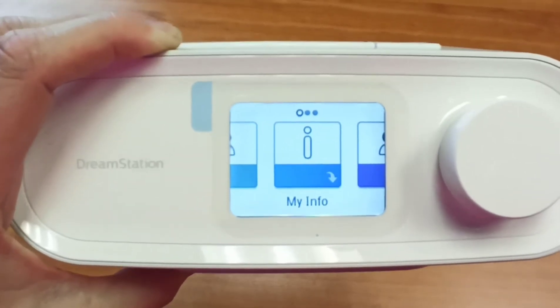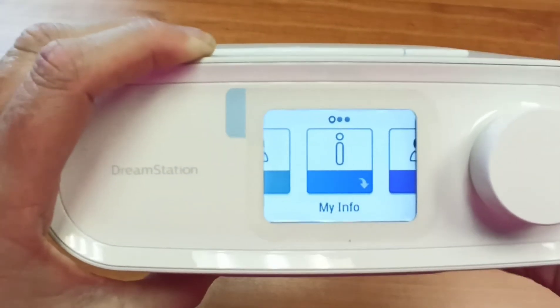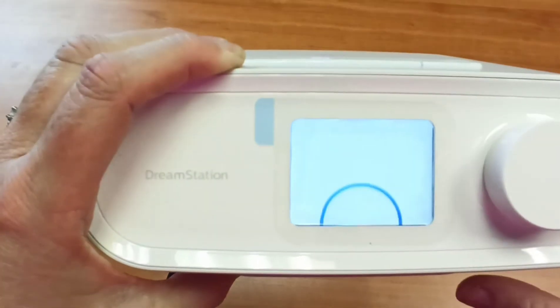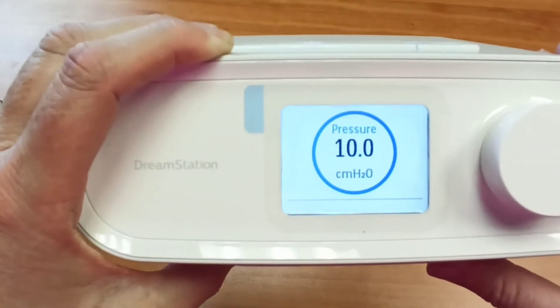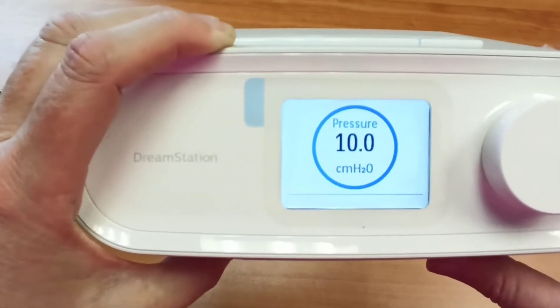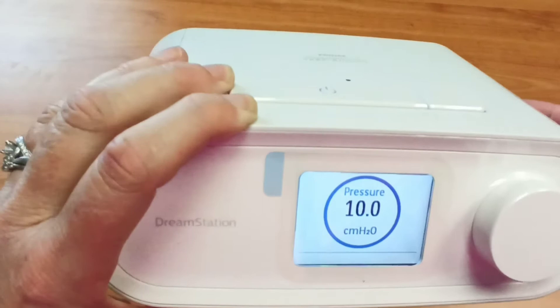Hi, this is Sarah with Sleep Therapy for you and I've got a Respironics Dream Station here and I'm going to talk to you about your ramp. When you turn your pressure on, it pops up in this circle, but you are not stuck on what it pops on at. You have the option to ramp your pressure down to make it gentle.